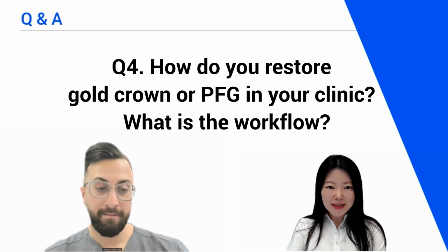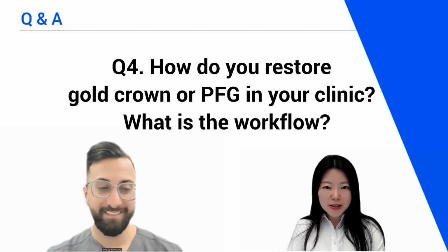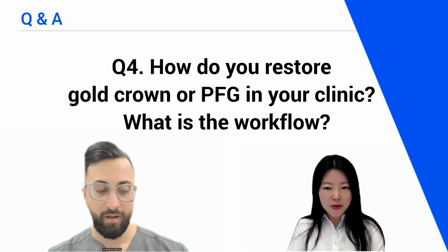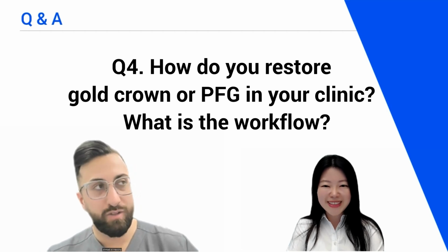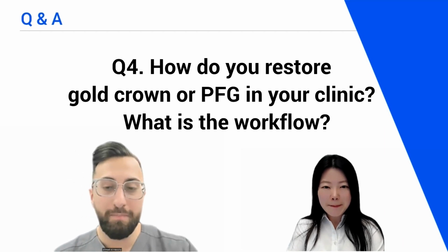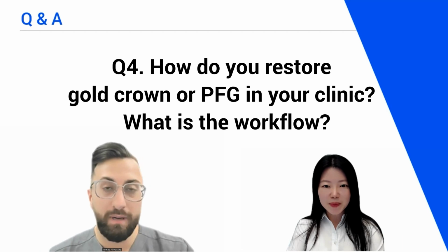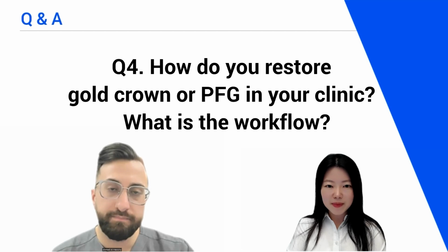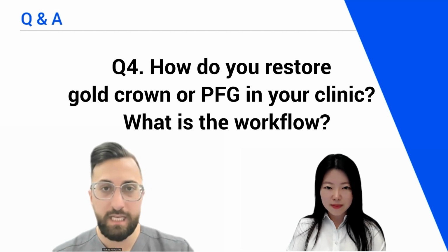Okay, last one. Question number 4. How do you restore a gold crown or PFG in your clinic? What is the workflow? Oh, I haven't had to do a gold crown in a very, very long time because I mainly do ceramic like Emax or zirconia. But the workflow would be exactly the same. Scan, temporize, send it to the lab.